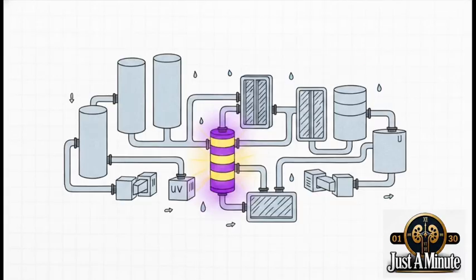Which leads us to the overarching takeaway from all of this. UV is just one single component of the overall dialysis water treatment system. It's a single, vital tool working alongside carbon tanks, reverse osmosis membranes, and ultrafilters in this highly orchestrated sequence. It plays its specific role flawlessly, for sure, but it relies entirely on the rest of the system to cover its blind spots.